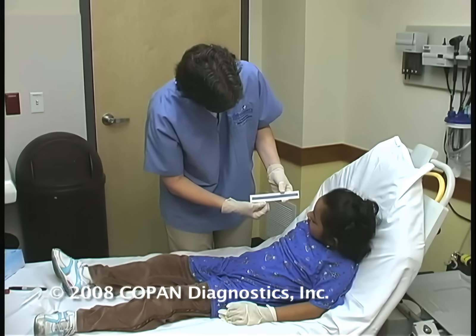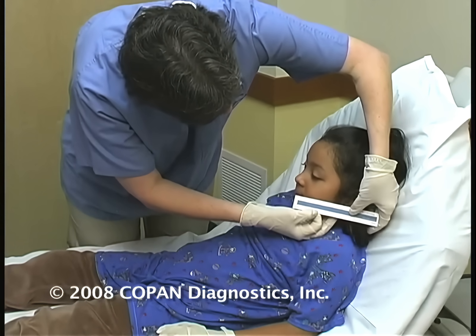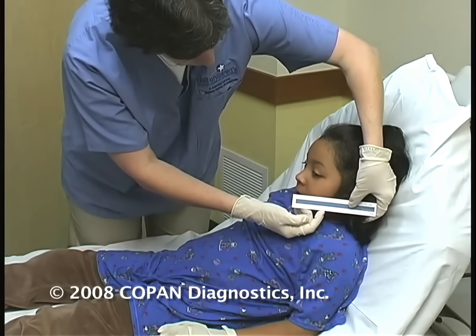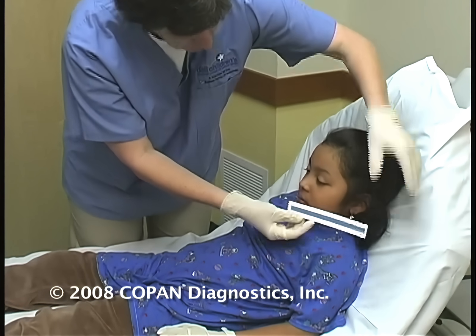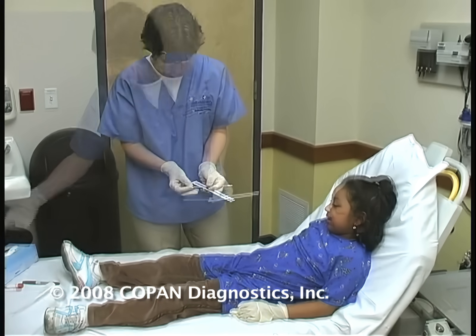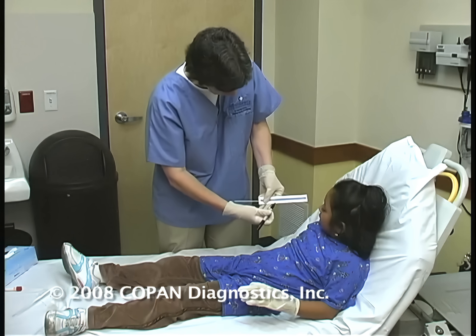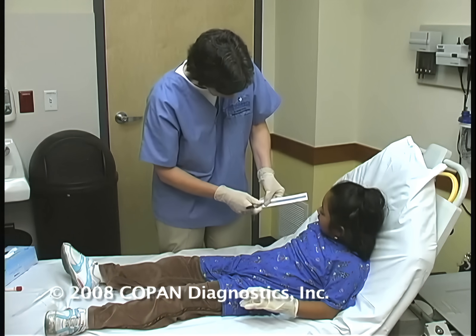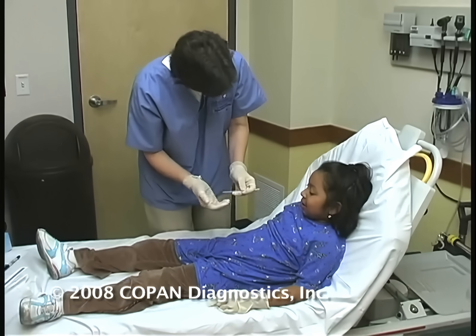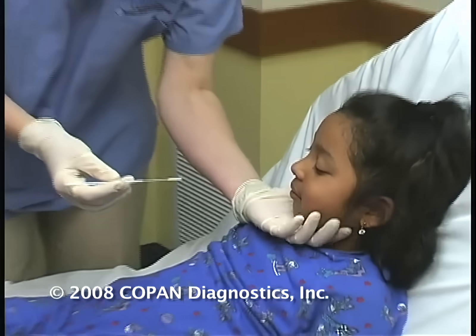We've got our little measuring stick here. We're going to put it from the base of her nose back to her earlobe. You can see that she is right at four inches. So on our swab, we're going to look at two inches to be the depth of insertion. We take our swab and a quick Sharpie marker and put a little mark right there. So we have our little swab measured, and she's already felt this — it's fuzzy, kind of a silly, tickly feeling. So she knows she's going to hold real still.